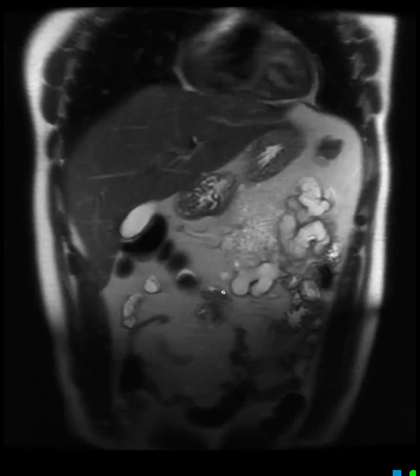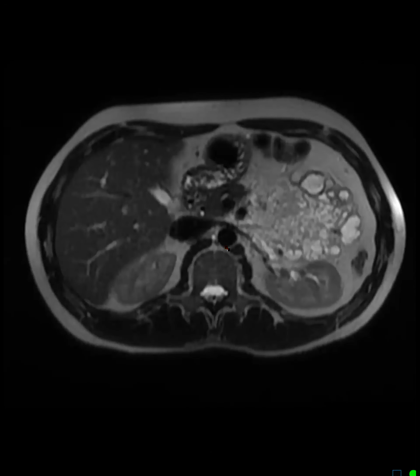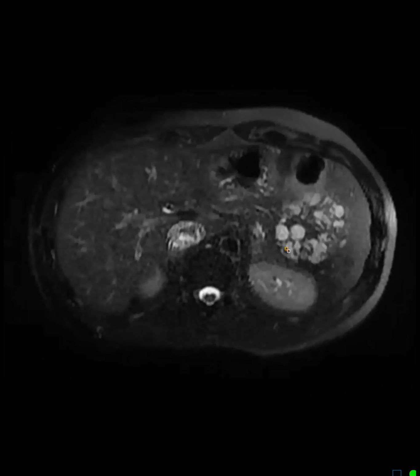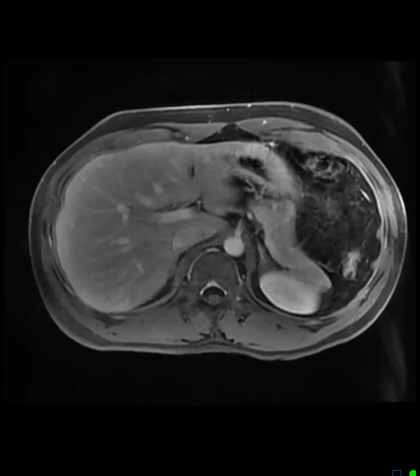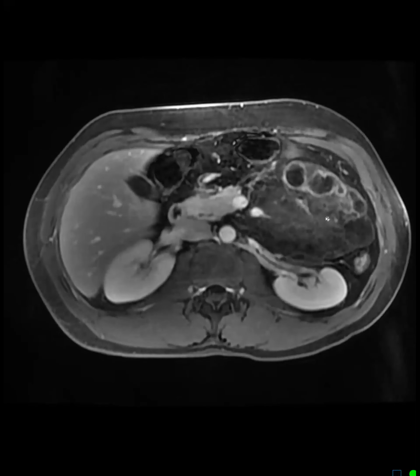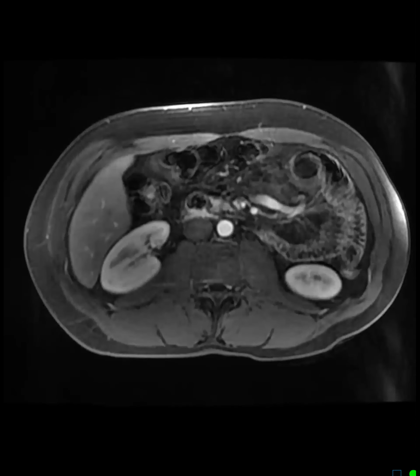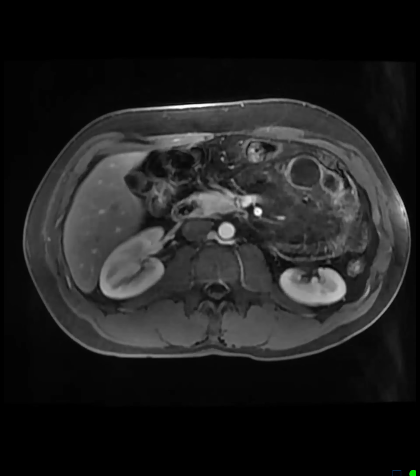And in the MRI, I can pull up this T2 axial, so you can see all these T2 bright lesions. Nice case. T2 bright lesions, and post-contrast we can see peripheral enhancement only, no nodular or suspicious solid enhancement. The patient was discharged, but I think this was a case of mainly mesenteric, but also slightly retroperitoneal involvement of diffuse lymphangiomatosis.